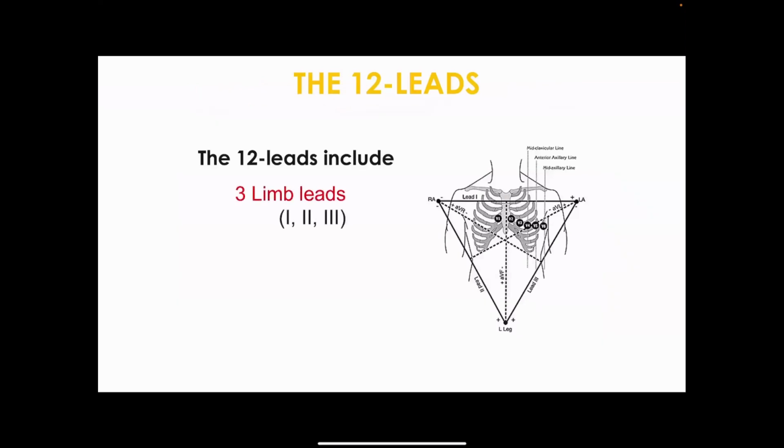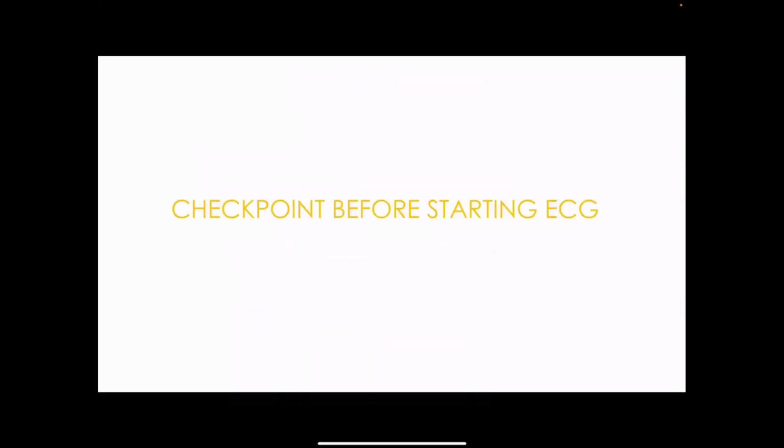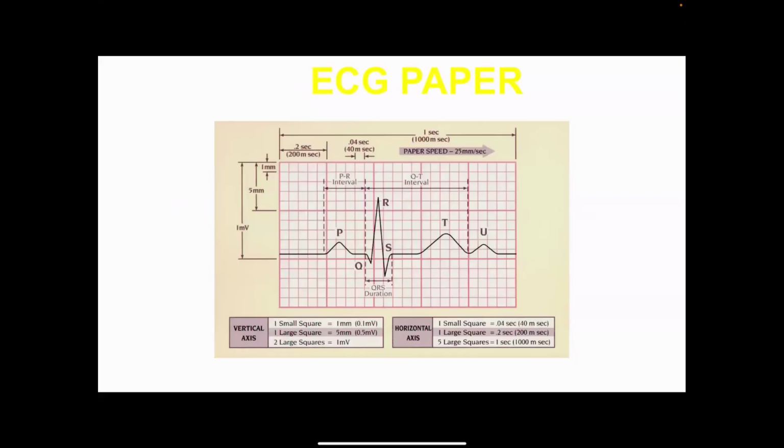Now, okay, we talked about these. These are all the leads in total. Now, before we start, do you understand the basics of ECGs? Yes, thank you. Okay. Now, we looked at this.